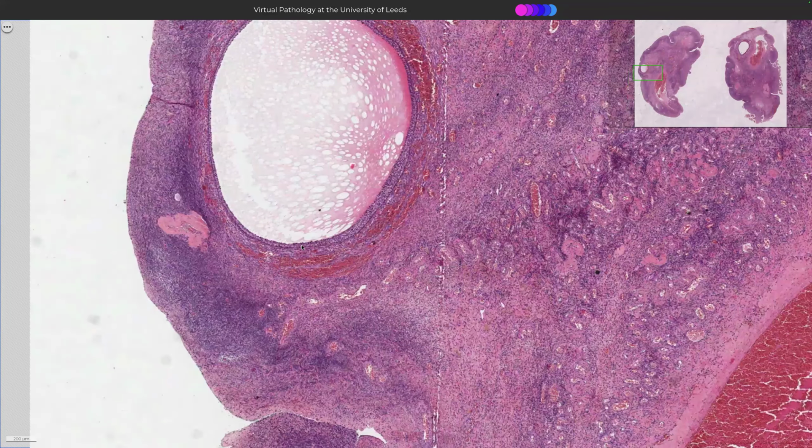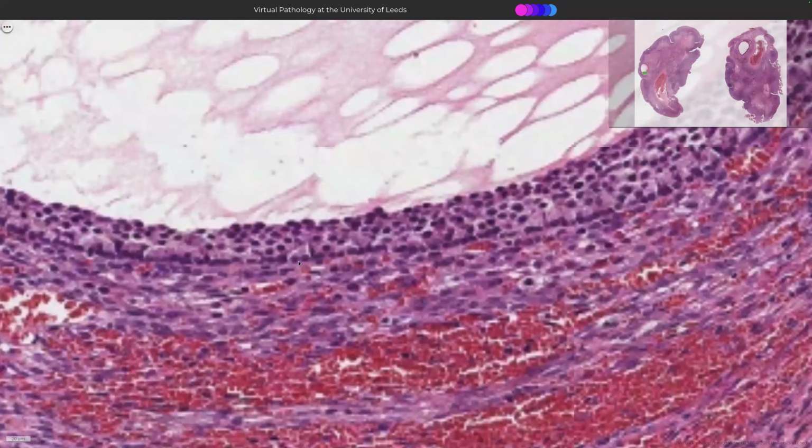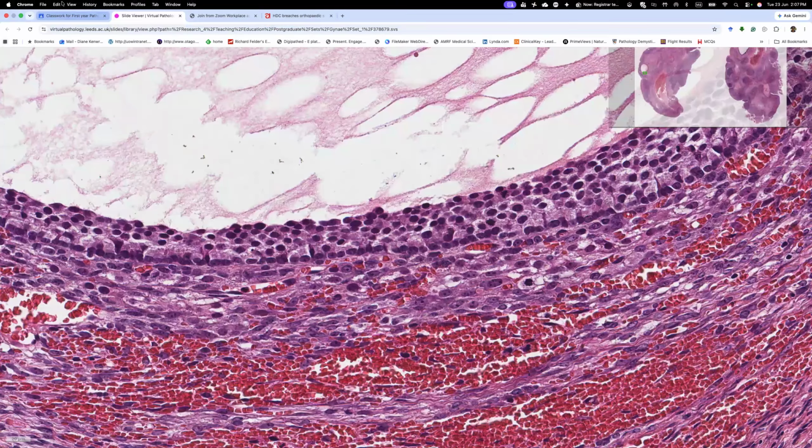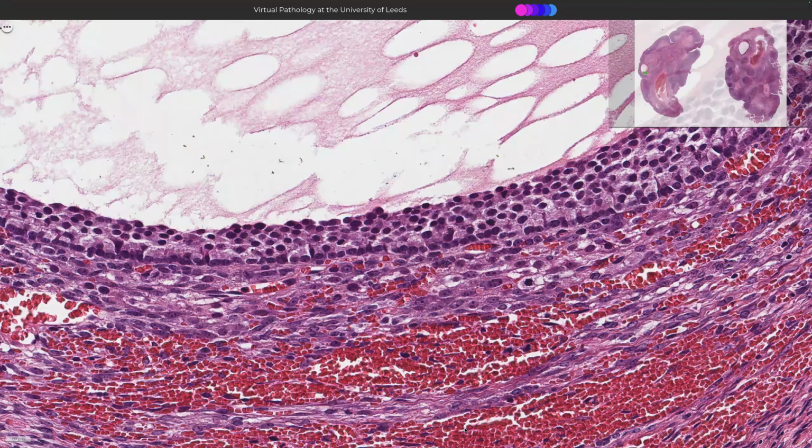And we're just going to wait for it to tile for a moment. All right. So who can tell me in the chat, which I've now got to find, what this inner layer of cells is? Here, this one here. What are these cells? Where is the chat? Here it is. Four people in the chat. They are the granulosa cells. Well done. And that means the ones on the outside here are the thecal cells.